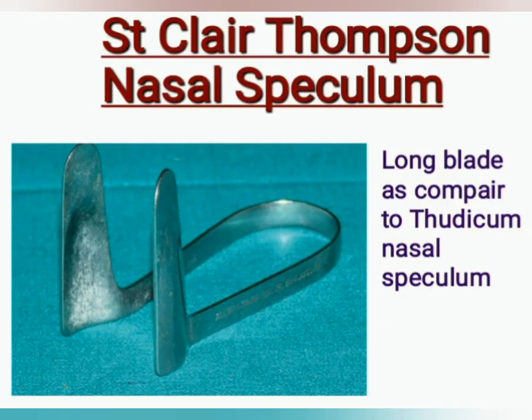Secondly, St. Clair Thompson nasal speculum. It has a long blade as compared to Thudicum nasal speculum. Therefore, it is mainly used for posterior rhinoscopy, meaning posterior visualization of the nasal cavity.